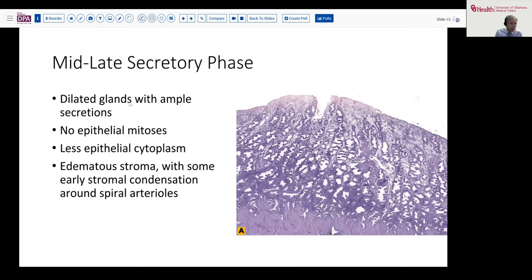As we move to the mid or late secretory phase of the cycle, the glands become much more massively dilated. The stroma is quite edematous as well, and there is no longer any evidence of mitotic figures. The amount of cytoplasm in the cells also begins to diminish. This is essentially the implantation stage, just prior to the formation of a decidual reaction. That decidual reaction will begin to appear first around the spiral arterioles and beneath the surface as you approach the later stage of the secretory phase.